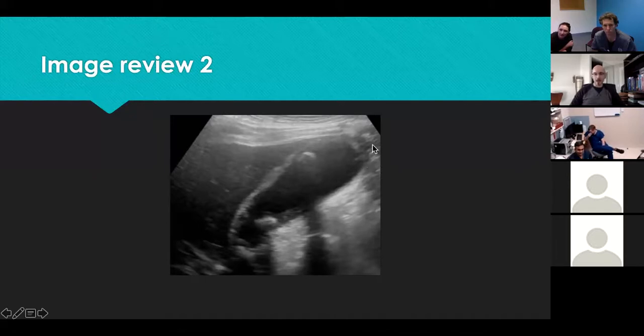We don't have the sides of the screen to see where they have put the focus on this one, but I assume they have optimized the image because you can see a very good shadow there. This one still creates a shadow, but probably we won't see it because this is one side of the shadow and the other side is hidden in the neck of the gallbladder wall.